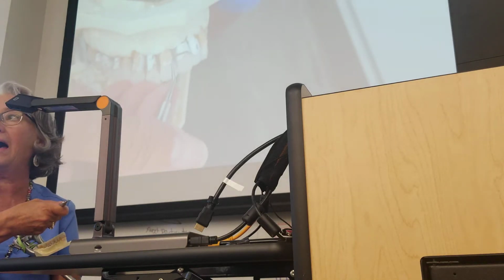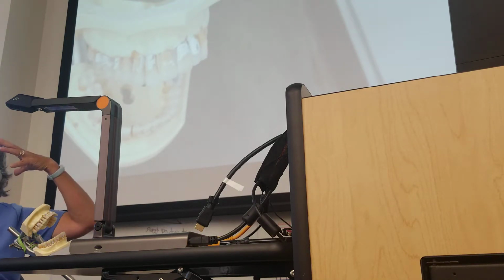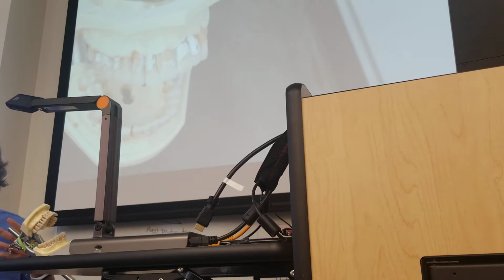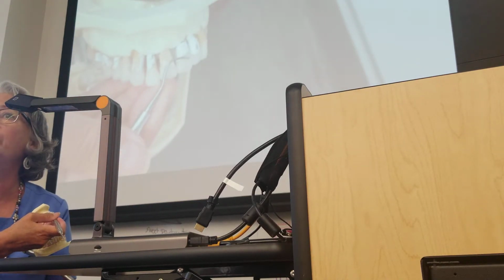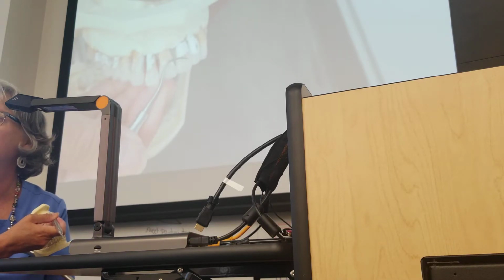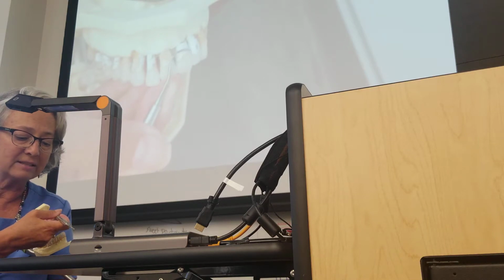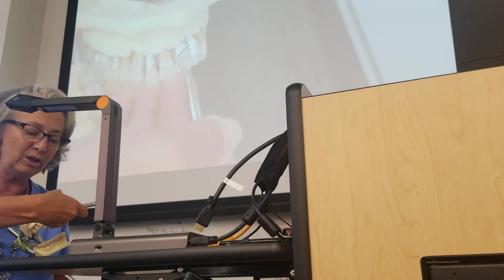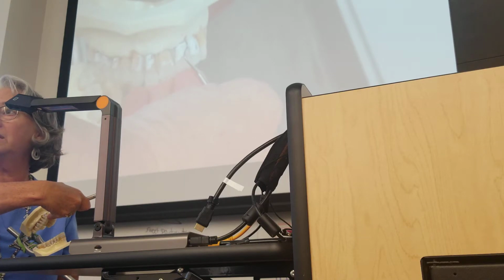The purpose of that is so that you do not have blades cutting the tissue in the pocket. If the face of the blade is as flat to the tooth as it can be, those cutting edges are not going to be cutting the tissue. So you want to insert as flat as you can to the tooth. Then you're going to open it up to your 70 to 80 degrees.